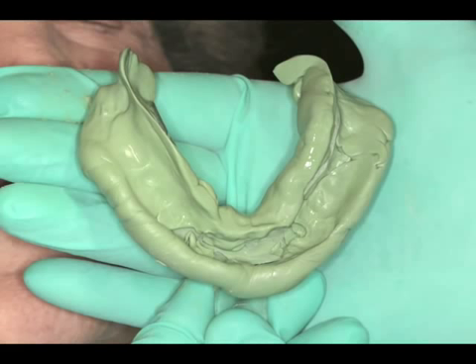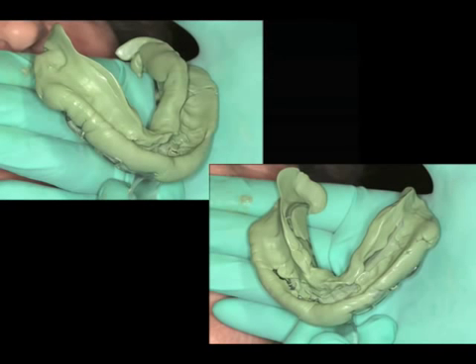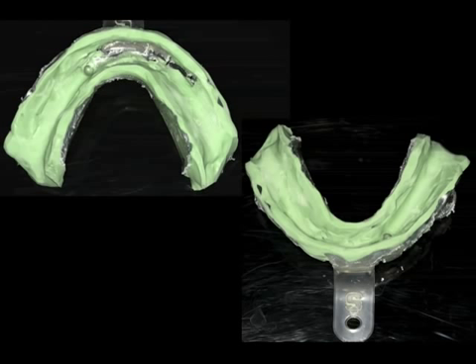And of course, some of the material has gotten around a little bit of the implant copings. That's not a problem. We'll just take a burr and reduce that. I want you to analyze this very closely to make sure that none of the tray has burnt through the impression material. This is another angle where you can see. And now we must, of course, not only trim any excess, but also any burn through the tray.